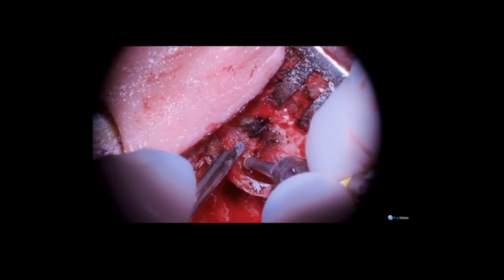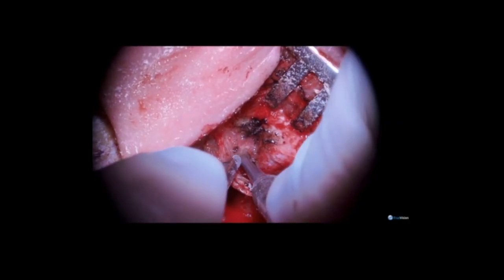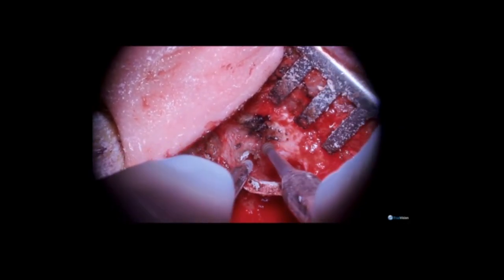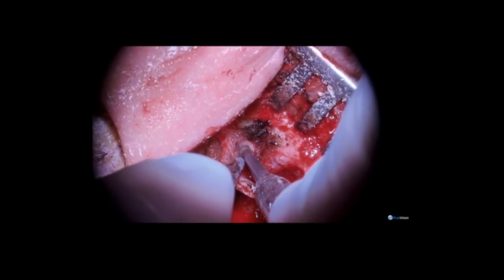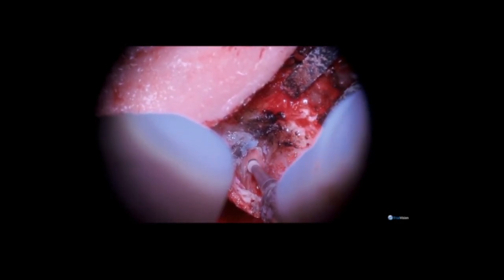I am using a 2mm diamond burr and removing the anterior aspect of the tympanic bone to make it flush with the scutal area and the anterior aspect of the external auditory canal bony wall. There is a fair amount of soft tissue that can be removed, and sequentially smaller burrs can be used to adequately perform this.